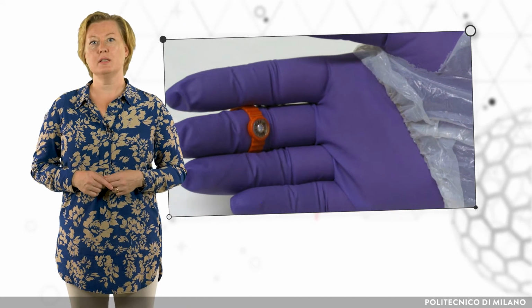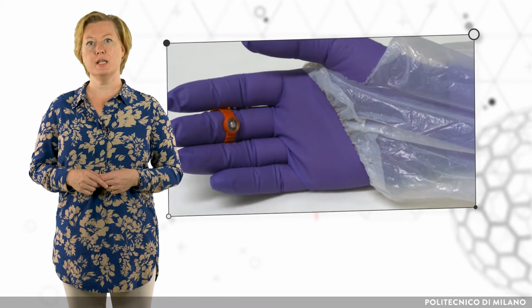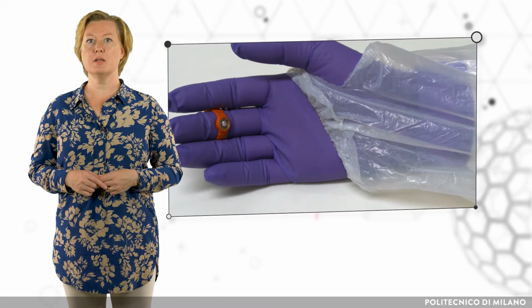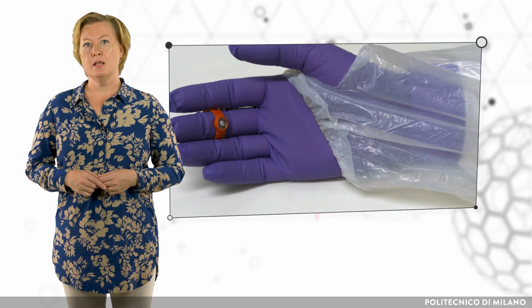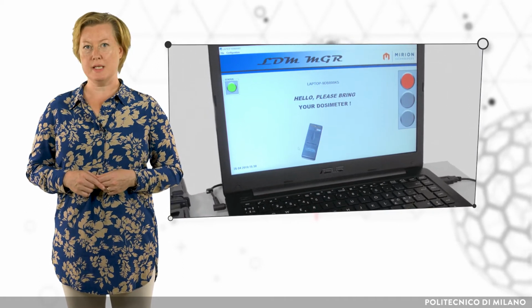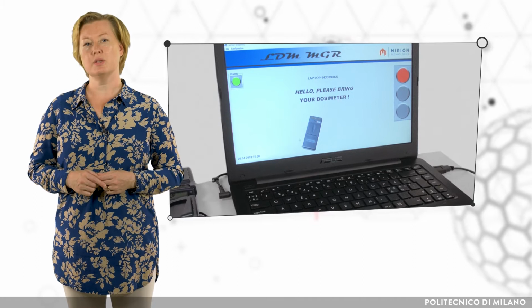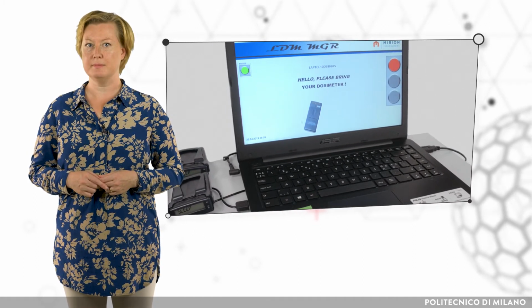The crystalline material inside the dosimeter traps the electrons during irradiation, which at a later time can be measured using light stimuli. The dosimeters are analyzed on a monthly to quarterly basis. This allows one to estimate the effective dose absorbed by the body.